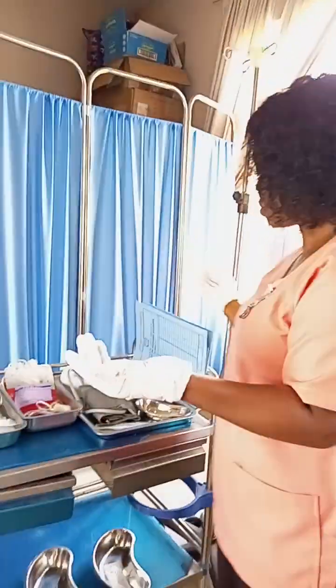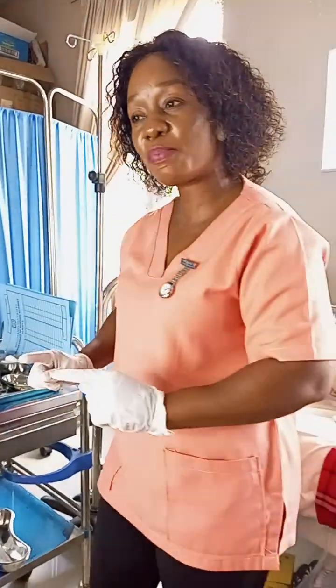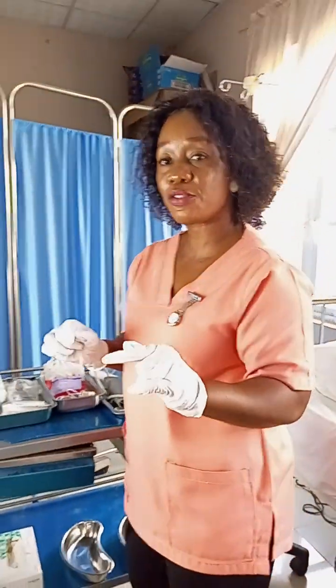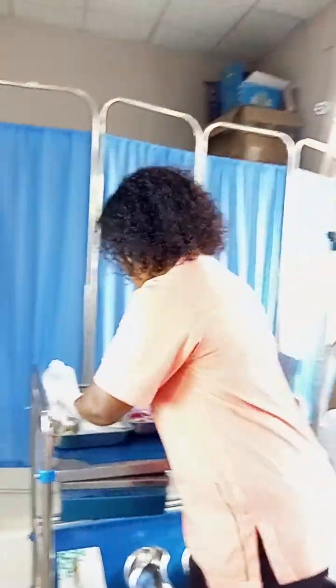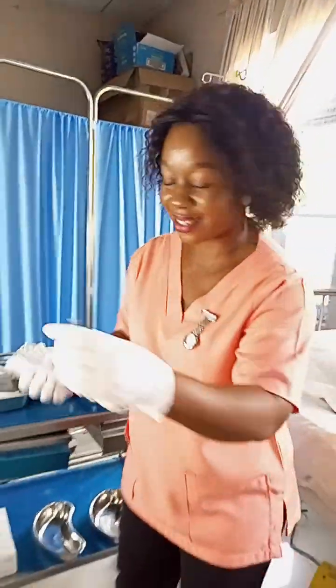The doctor has prescribed pre-transfusion medication. So the next thing, if you are doing this procedure, is for you to administer the pre-transfusion medication. Most times, the patient is placed on furosemide. So I pick the furosemide. Of course, remember this is a dummy, and I may not break it.